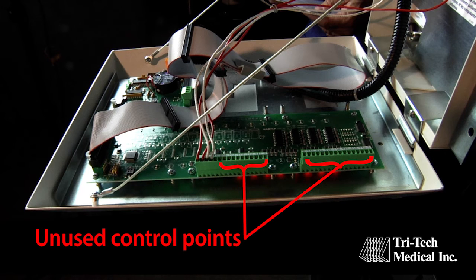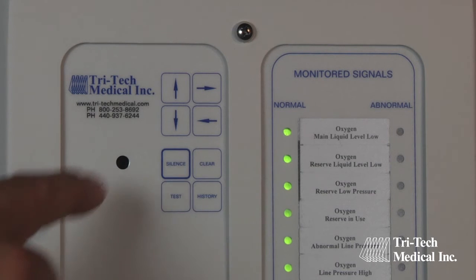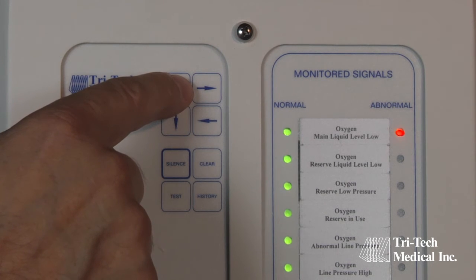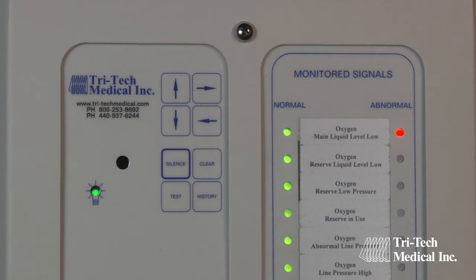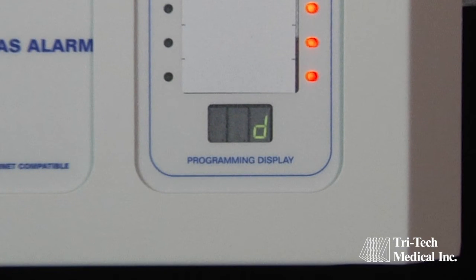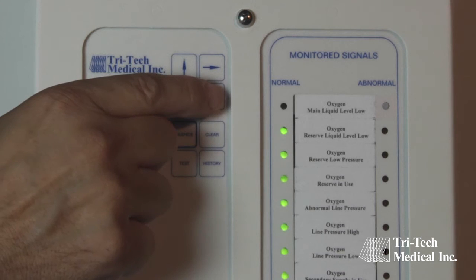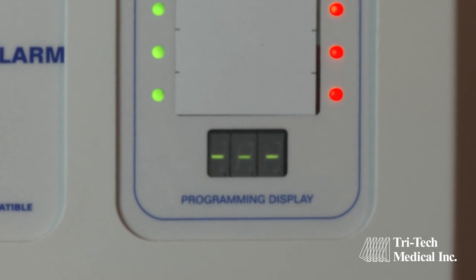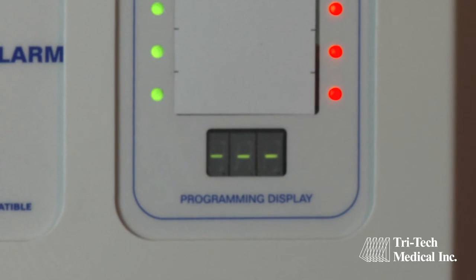Signal points which are not connected to source equipment may be disabled by pressing either the up or the down arrow button to select the condition where both the green and red LEDs are blinking on and off. The letter D, which denotes disabled, will be displayed on the LED display at the bottom of the board. Next, save this programming by pressing the left arrow button. Any additional unused signal points may be disabled in the same manner.